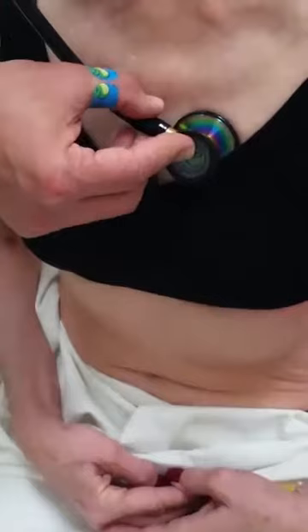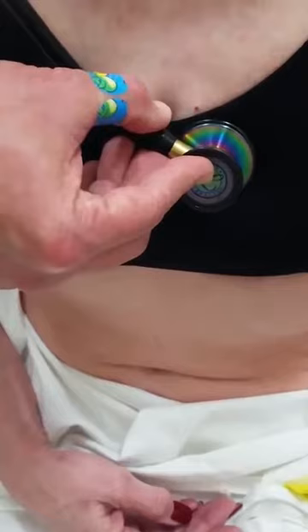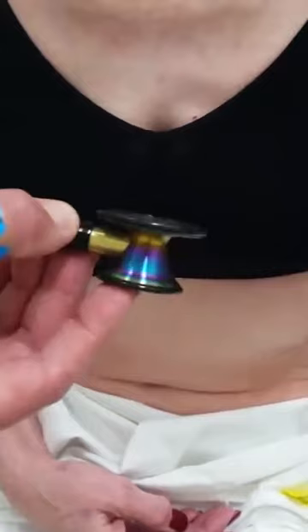Moving then down to the fifth intercostal space just to the left of the sternum. Remembering that if you're dealing with a female patient who has large breasts, you may have to ask them to displace some of their breast tissue with their hand. The final auscultatory place is at the fifth intercostal space mid-clavicular line.